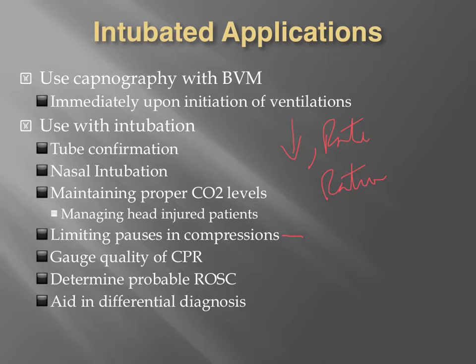We should be doing continuous compressions at all possible, and we should be limiting our pauses to less than 10 seconds, preferably less than 5. So when we're doing CPR and utilizing capnography, we may actually have cases where we're working a patient and we don't need to stop every 2 minutes. Some people freak out when you say that, but let's face it, we don't always need to stop every 2 minutes. And in some cases, the only reason we're stopping is because we're getting fatigued from CPR.